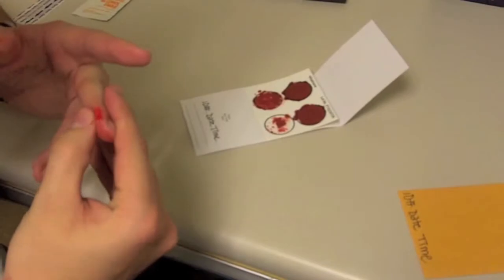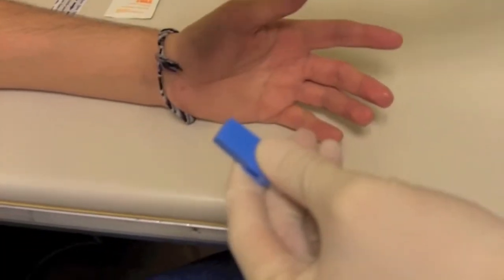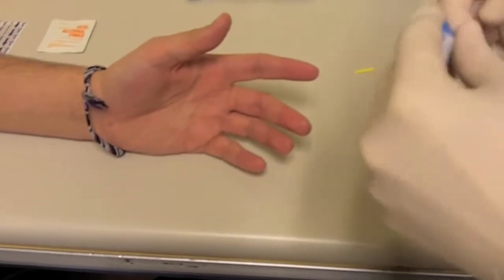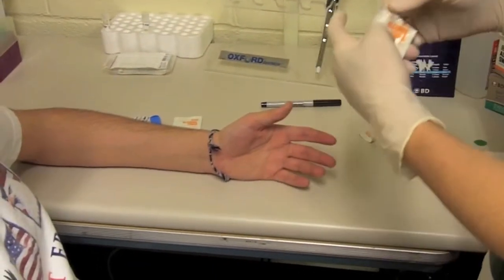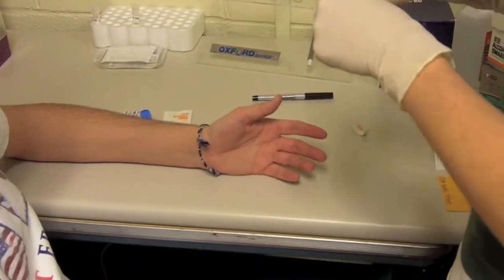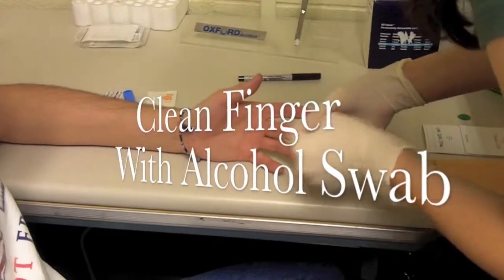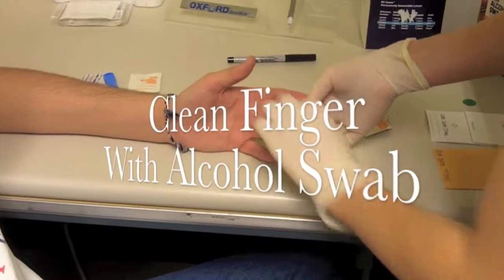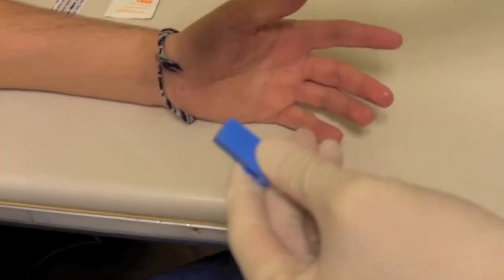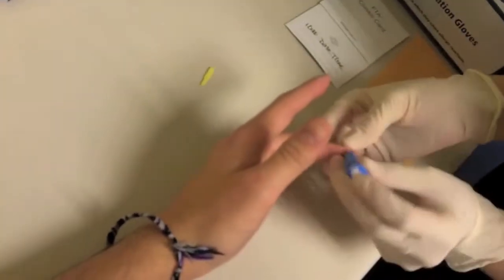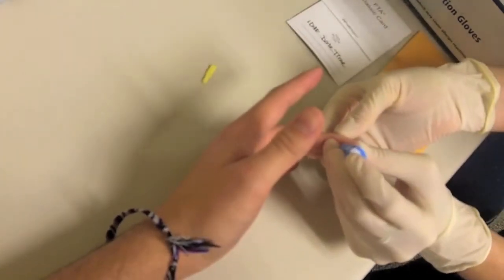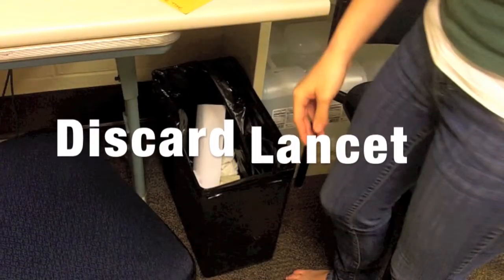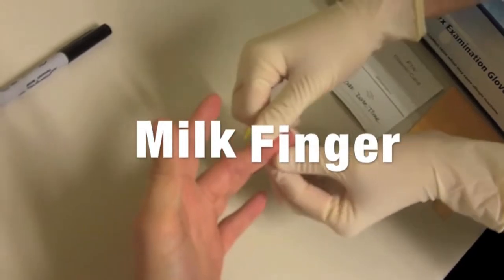If a participant is affected by the sight of blood, they should be instructed to sit down. Be aware that some participants may want to apply this procedure to themselves while others will want you to do this procedure for them. Although both methods are acceptable, the actual pricking of the finger with the lancet should be performed by the experimenter. Either way, the experimenter must always be wearing gloves. Instruct the participant to carefully clean their middle finger with the alcohol swab. This is where the lancet will be applied. Hold the self-contained lancet between their middle finger, towards the top of the finger and slightly off to the side as demonstrated here, and thumb with the trigger button towards the thumb. Squeeze the lancet. The button will trigger and the lancet tip pokes out into the skin and then quickly retracts. After one use, the lancet cannot be set off again. Discard the lancet.